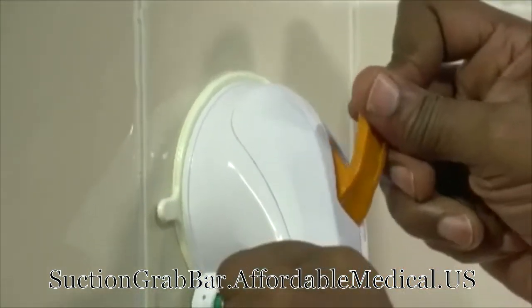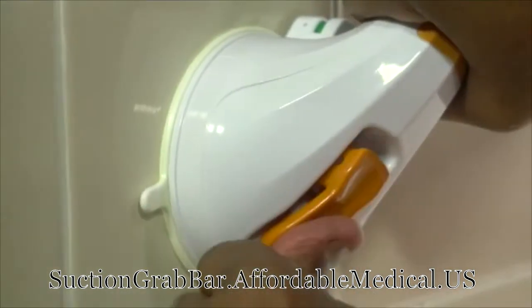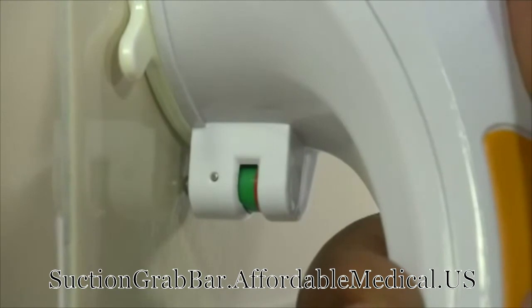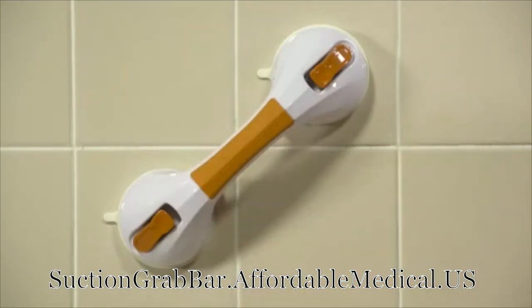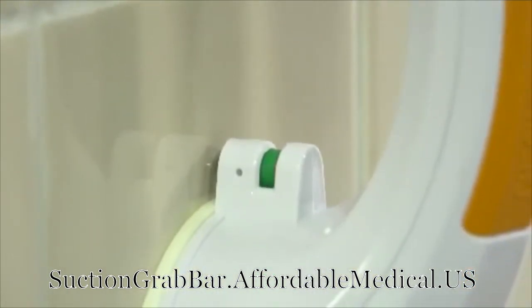Now, press down on one tilting lever, like this, then the other one. The indicator on the side of the suction cup will change from red to green to show that you've got the proper suction and a safe and secure hold. You'll get a feel for the vacuum strength once you've used it on a regular basis. When both indicators are green, you're ready to use the bar for balance assist.